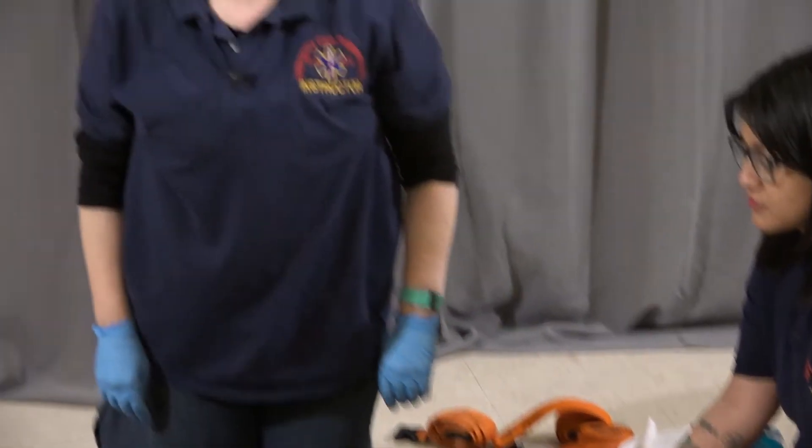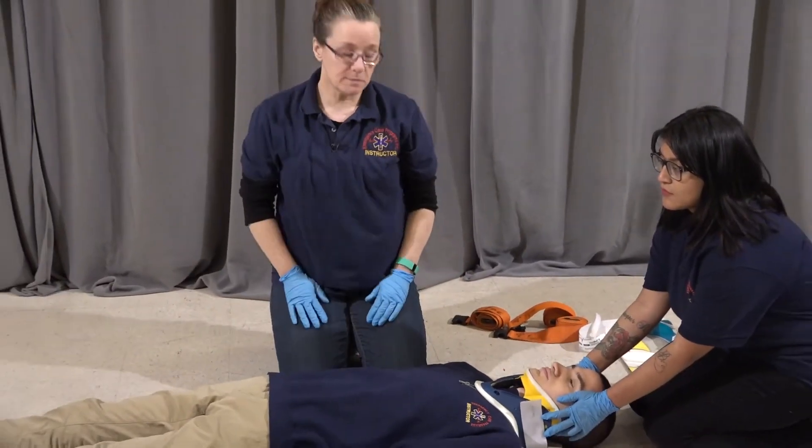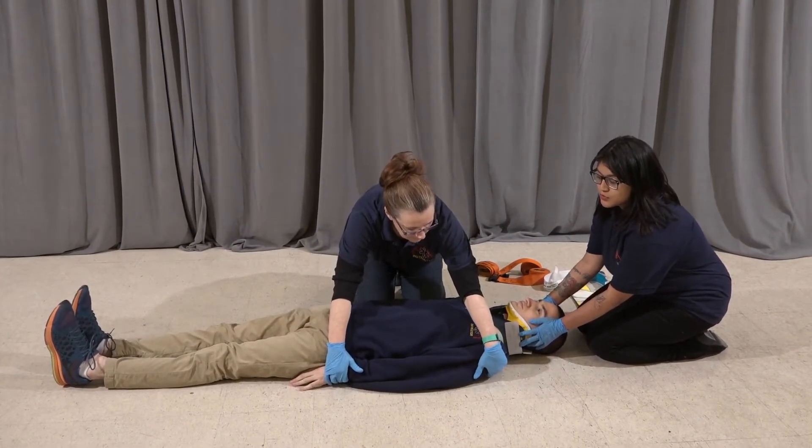I'm now ready to log roll the patient and insert the backboard. I'm going to have my partner assist me with that. The first thing we're going to do is log roll. We're going to move on their count of three. One, two, three.